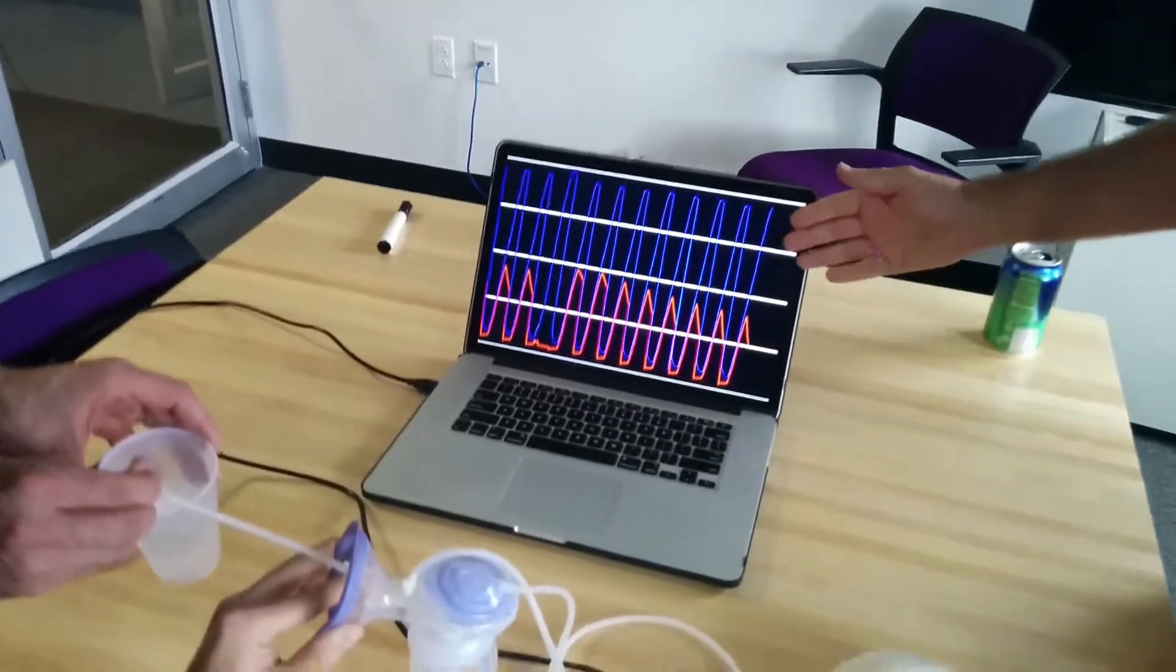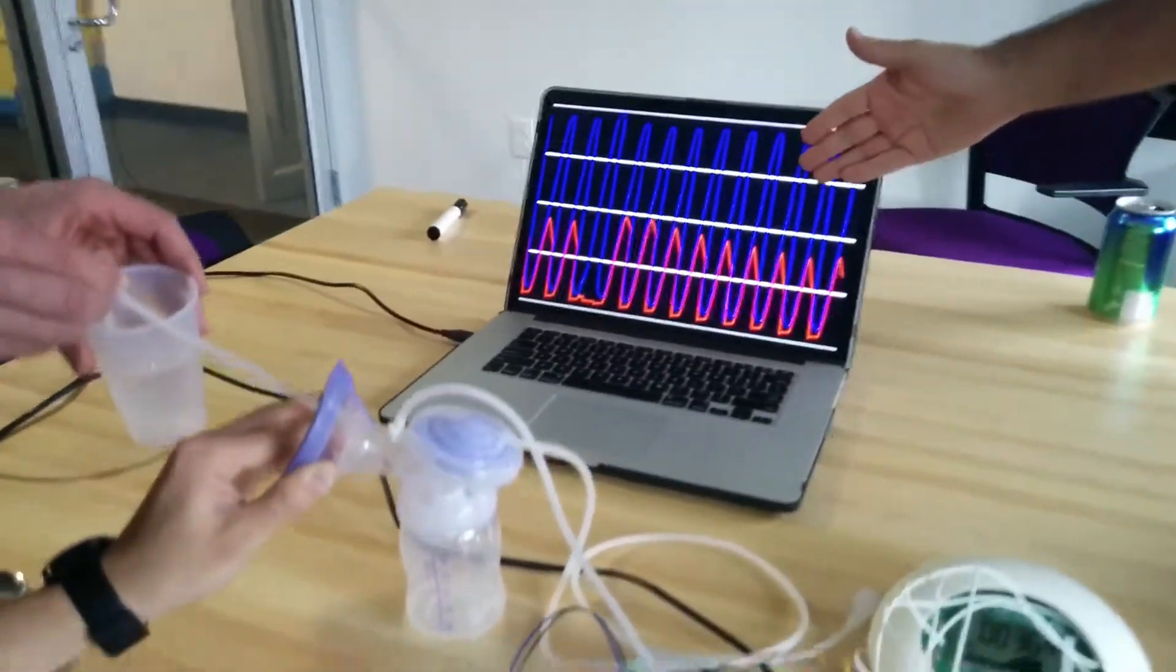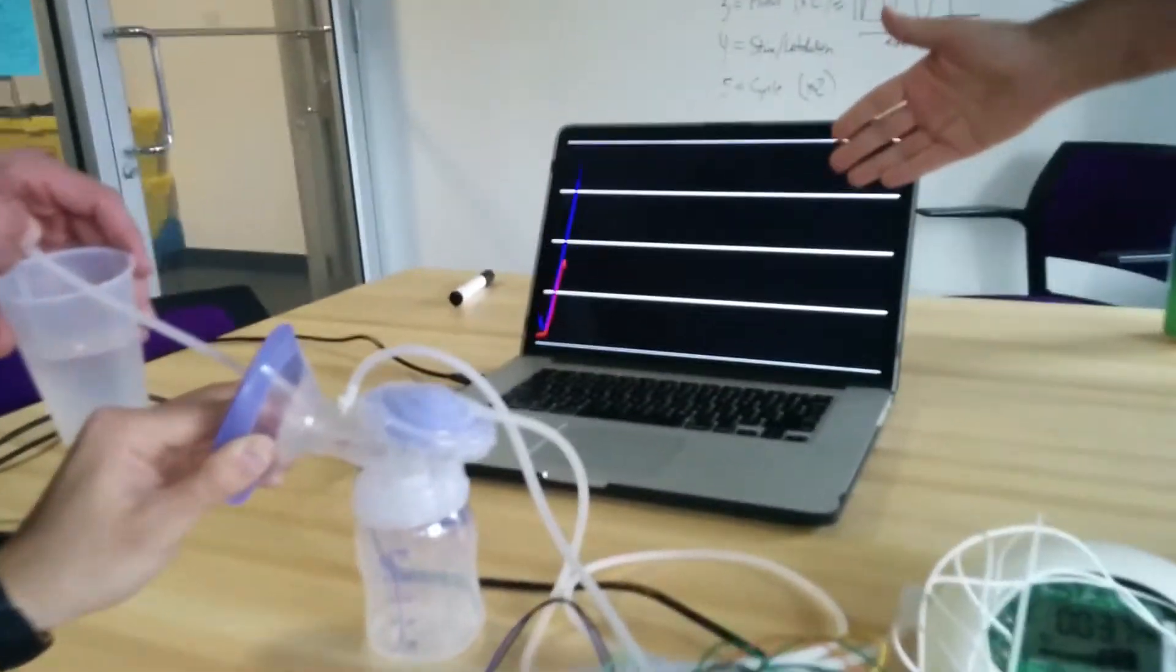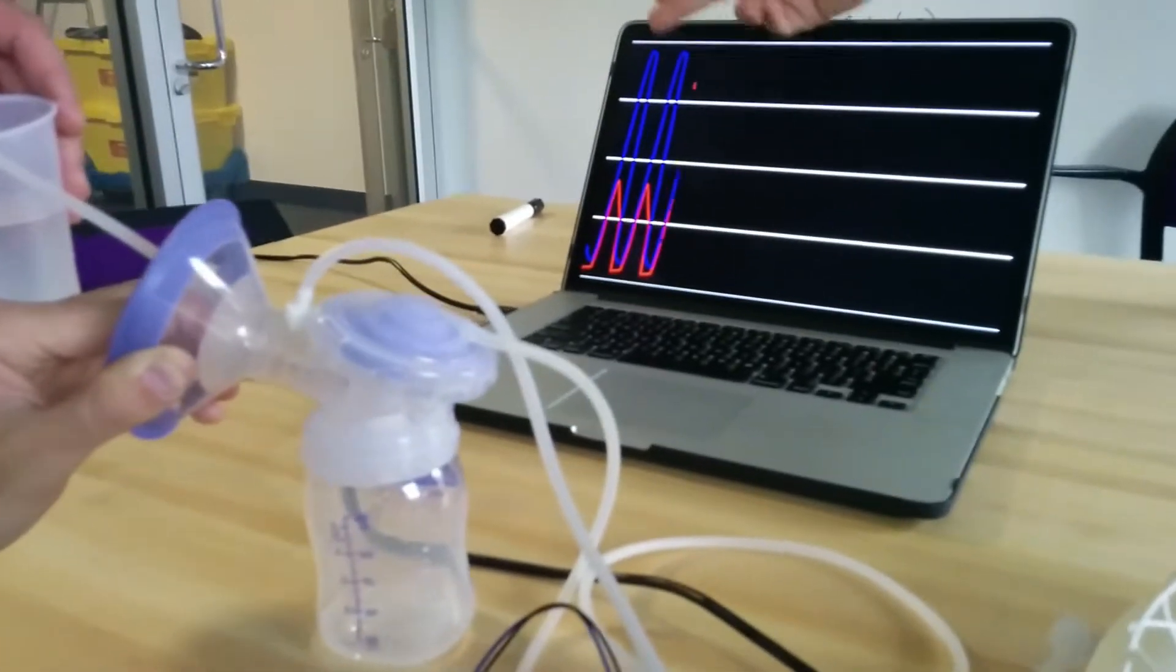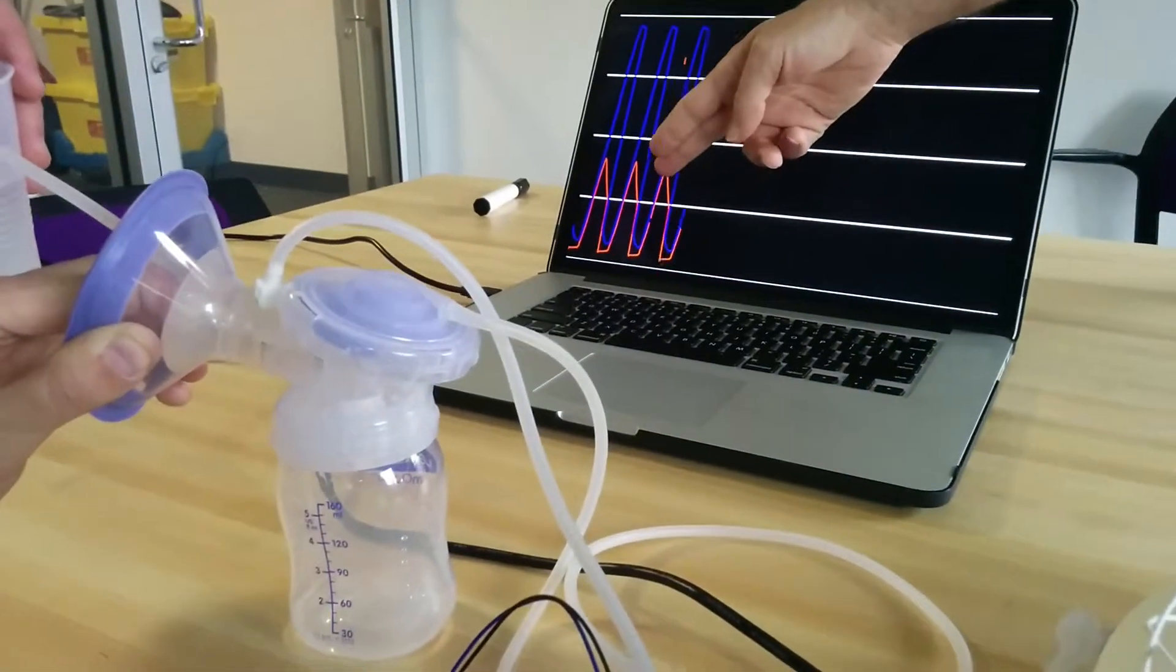What you can see here is a visualization of the pump vacuum strength. The blue line is at the pump and the red line is at the flange.